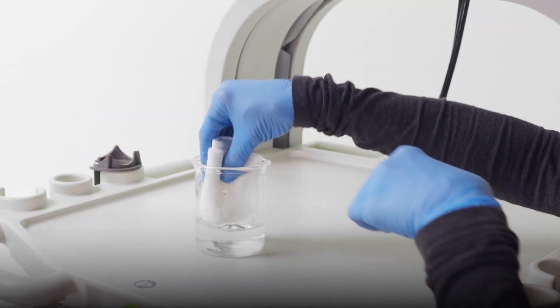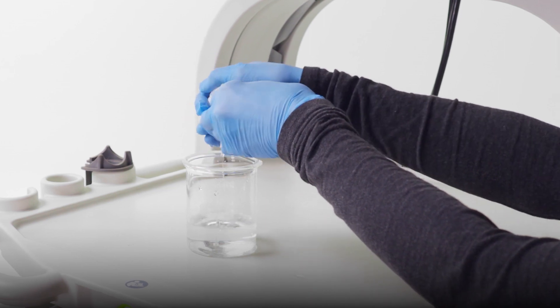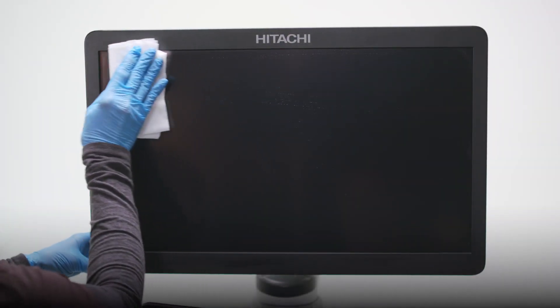Use another lint-free cloth dampened with water and thoroughly wring it out to wipe off any remaining detergent or disinfectant.